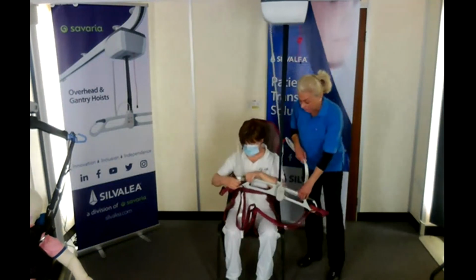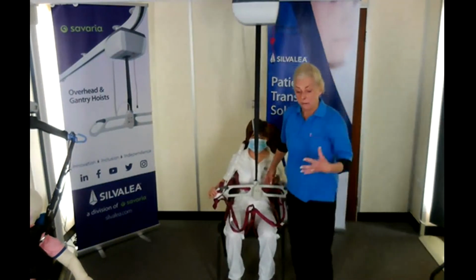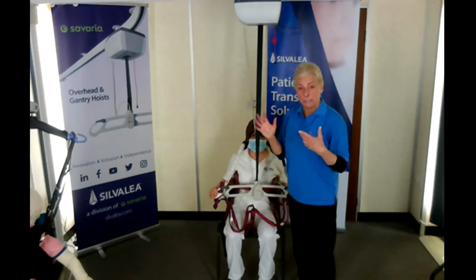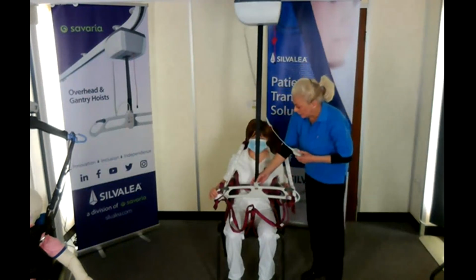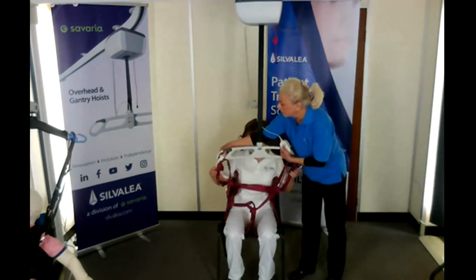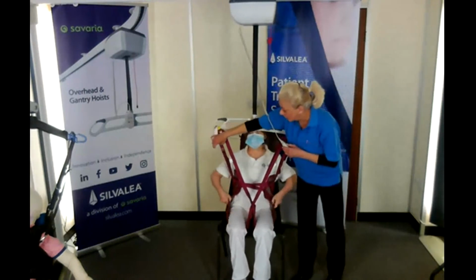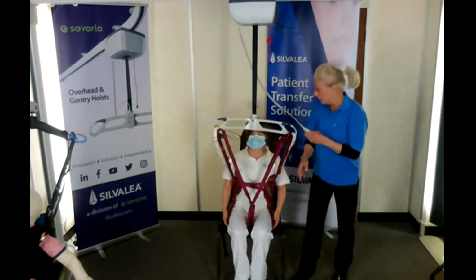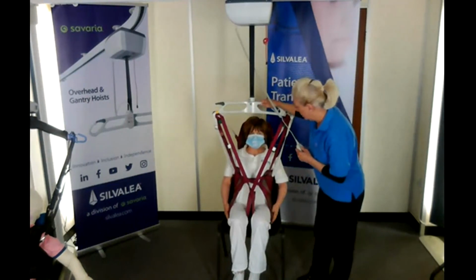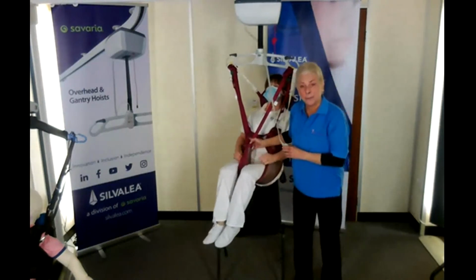If we've got a 2-point spreader bar like this one, then ensure that it goes on last, because if someone has got movement, it will let them move. It will flow on top, so it's not going to restrict the movement, but it will just control it. So I'll just slowly take up the slack here. The counterbalance straps have got adjustment with the slider buckle here, so that we can extend it or tighten it accordingly. So it's really important we just check it's going to fit firmly. We're looking at a situation where someone is very, very active, very wriggly.